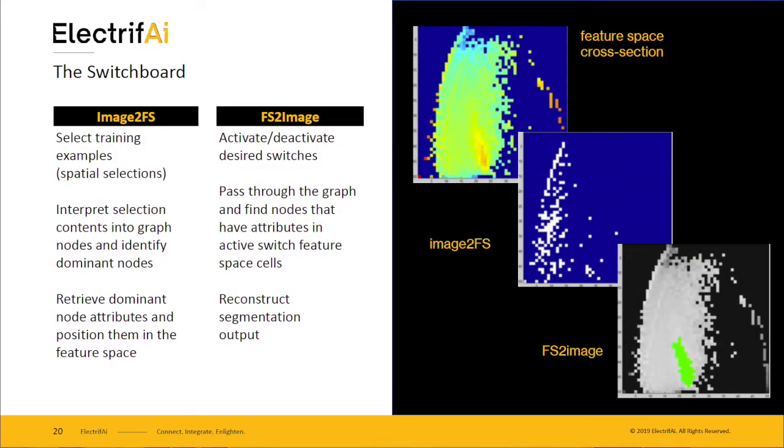So here is an example, and there is a cluster there. It's like a falling star pattern, and in this specific feature space, at the top left corner we have the origin, and as we move down the scale, we have features of high compactness. As we move towards the right of the image, we have increasing size of structures. So over there, we have something that is repeating with respect to compactness and size. This is a very simplistic example. You can have that, as I said, with 120 different such features, and you can draw a very nice decision surface that best describes what it is that you're looking for.